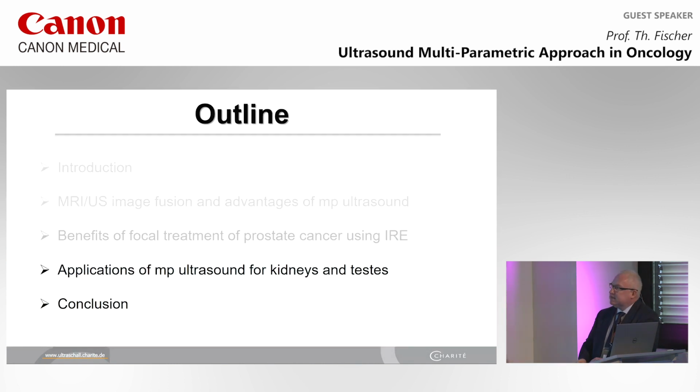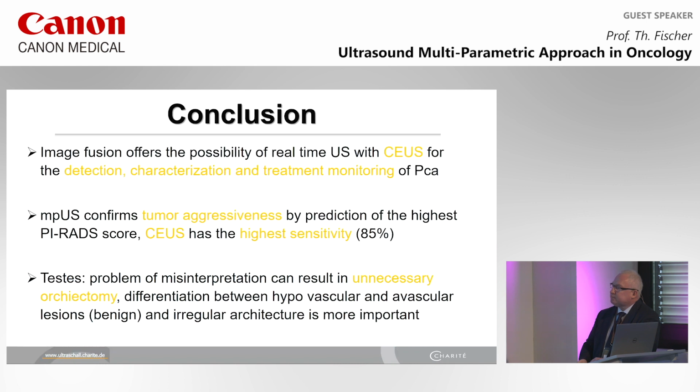And of course, this is work in progress. In conclusion, ladies and gentlemen, we are absolutely in time. Image fusion offers the possibility of real-time ultrasound with contrast-enhanced ultrasound for the detection, characterization, and treatment monitoring of different cancers, including prostate cancer. We can confirm tumor aggressiveness, by the way. And I think, interestingly for me, contrast-enhanced ultrasound has the highest sensitivity in this setup.